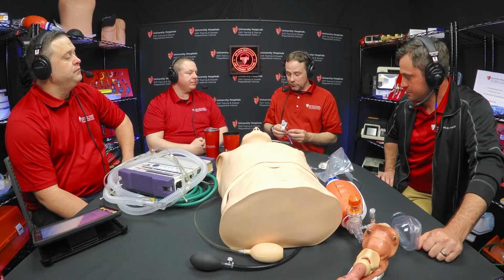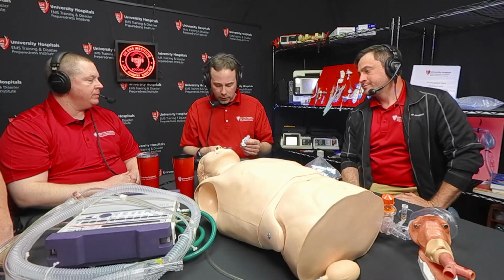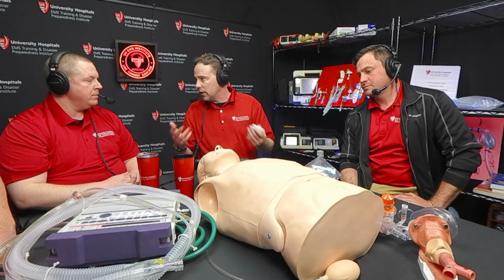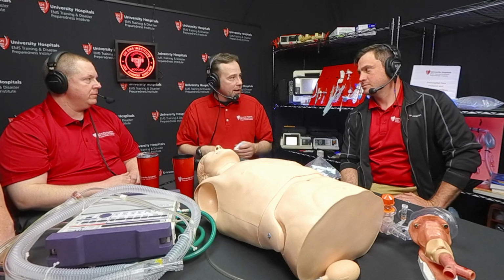I've had a couple of calls over the years where we've gone into, say, a vent unit in a nursing home, and they'll call us for hypoxia. You'll walk in, you'll assess the patient. Sure enough, the patient's hypoxic. They look like crap, pulse ox to match. You squeeze that and it's flat, and you put a little bit of air in it.